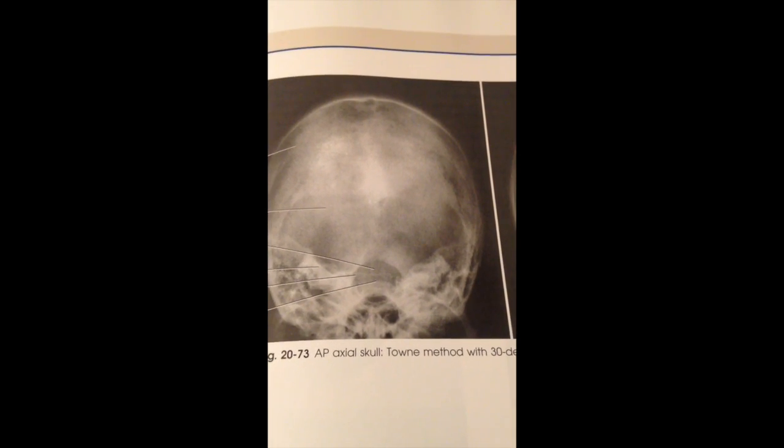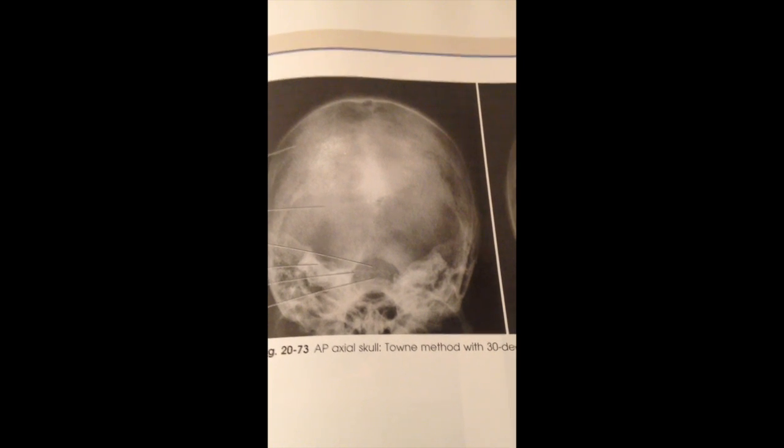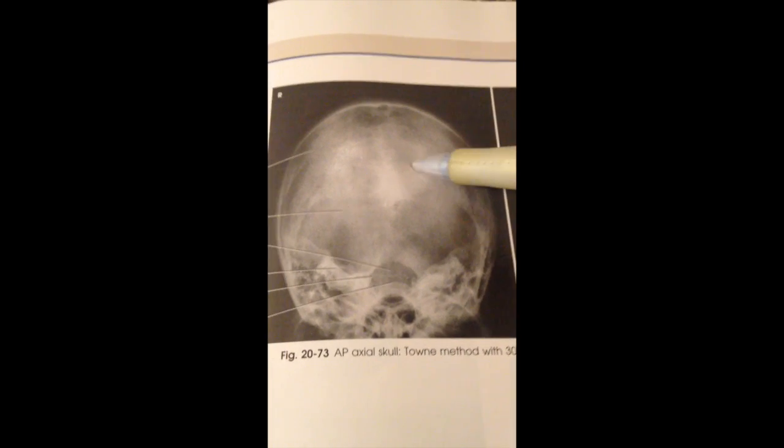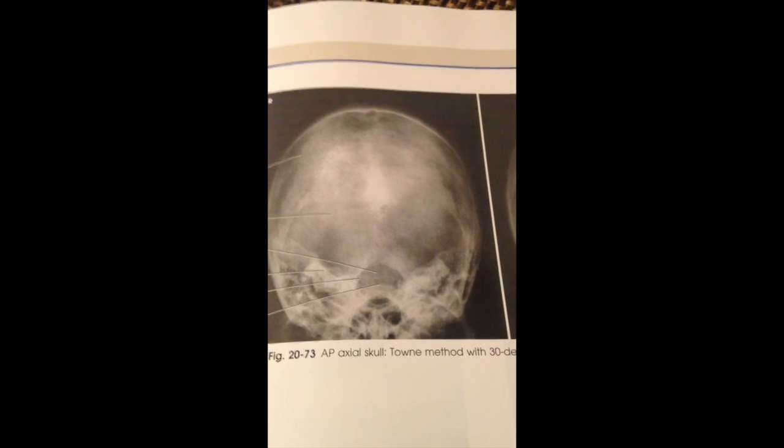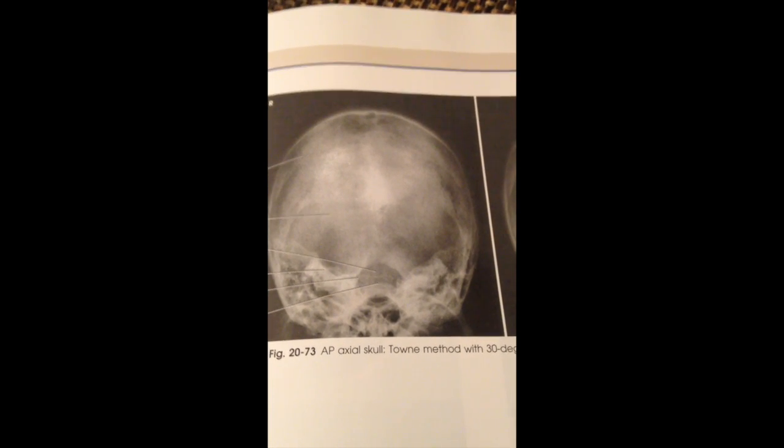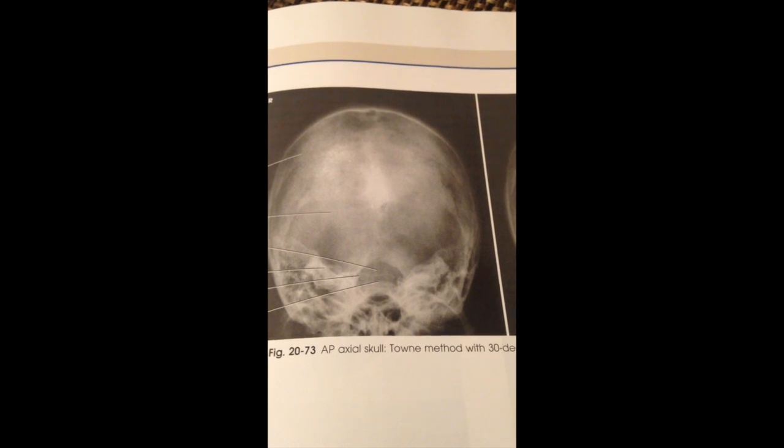It shows evidence of proper collimation, the entire cranium without rotation or tilt. It shows equal distances from the lateral borders of the skull to the lateral margins of foramen magnum on both sides. It shows symmetric petrous pyramids.